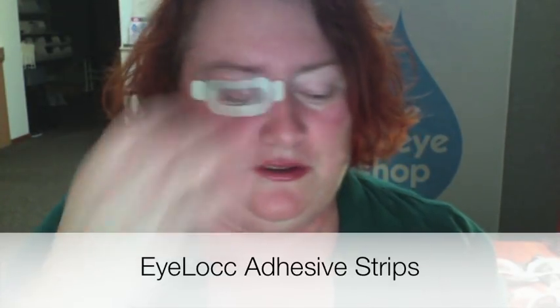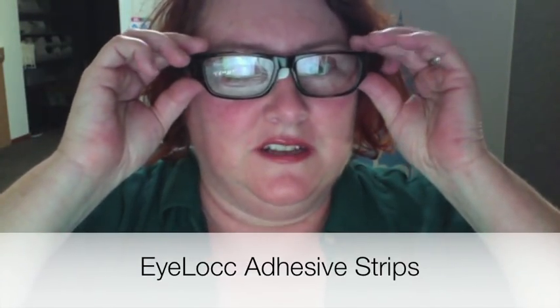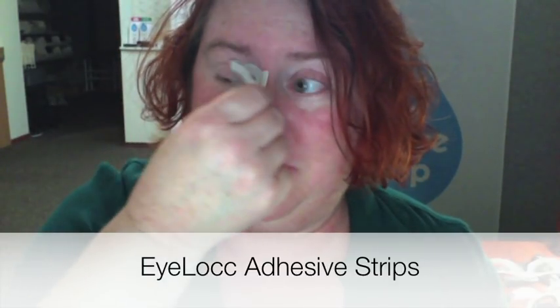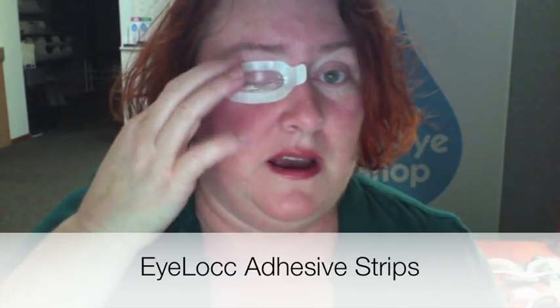This is again something that you could conceivably wear under glasses during the day if you needed to, but these are used primarily at night. One of the pluses is you get up in the night — it's just so much easier to take it by the tab and lift it so that you can see, and then push it back down afterwards.